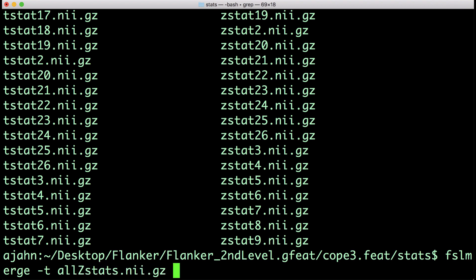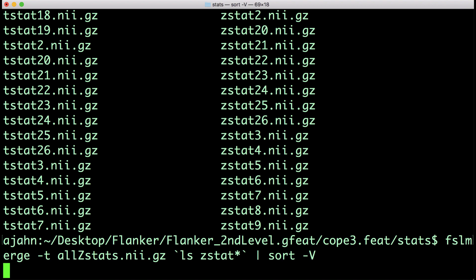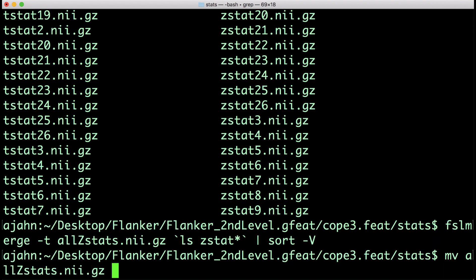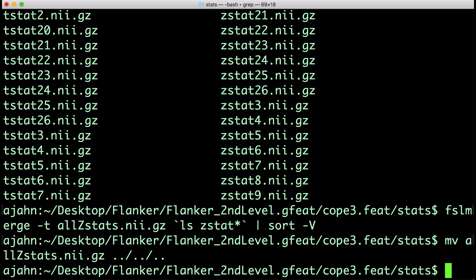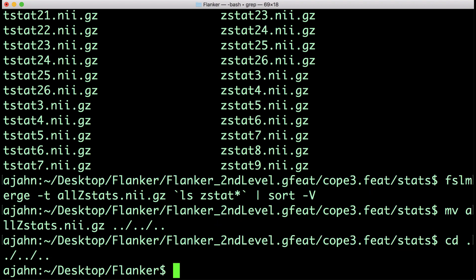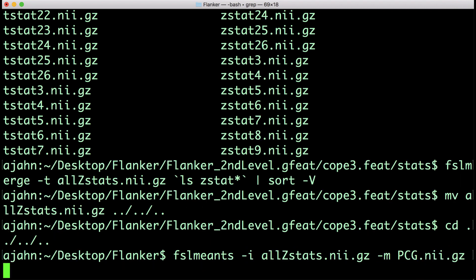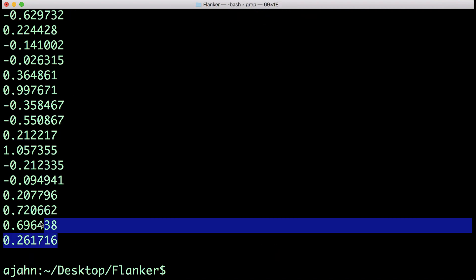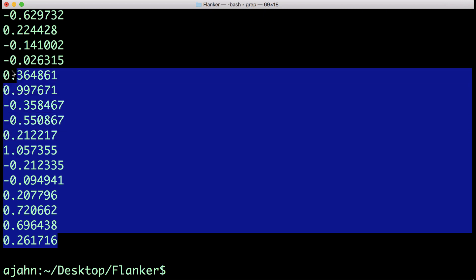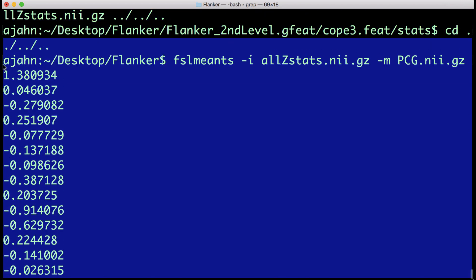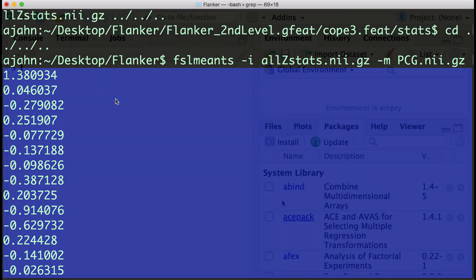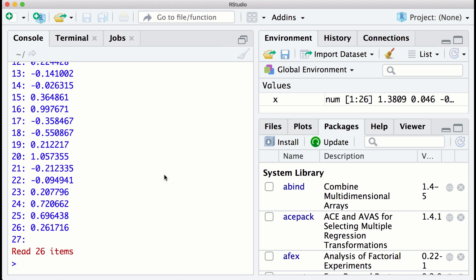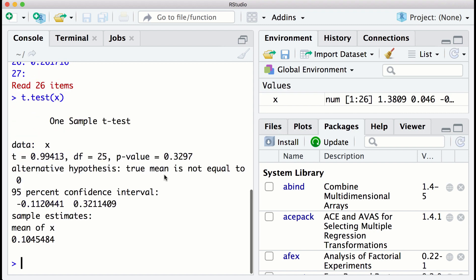To do this, we will use a combination of FSL commands and Unix commands. For more details about how this command works, see the link for the book chapter in the More Info box down below. Move the allzstats.nii.gz file up three levels so that it is in the main Flanker directory. Then use the FSL meanTS command to extract data from the PCG mask that we just created. This will print 26 numbers, one per subject. Each number is the contrast estimate for that subject, averaged across all of the voxels in the mask. You can then copy and paste these numbers into a statistical software package, such as R, and run a one-sample t-test to see whether the contrast estimates are significantly different from 0.